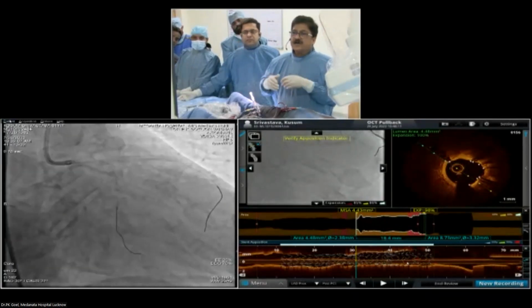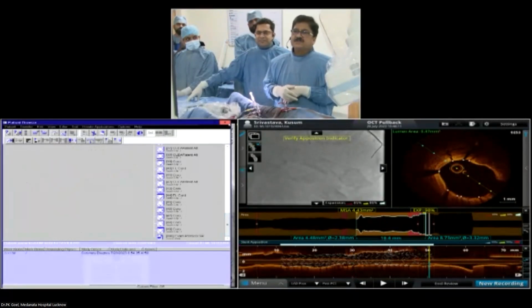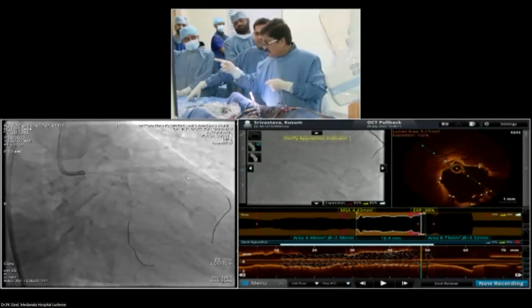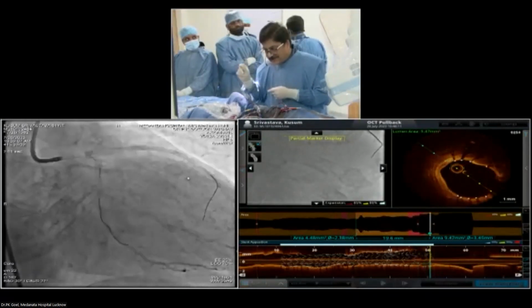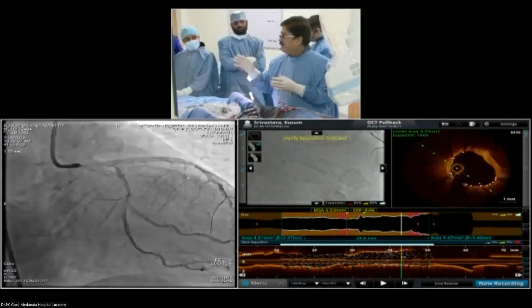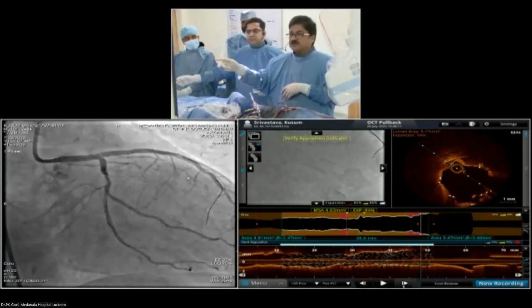So you put a stent from the mid part of the LMCA to the LAD. Yes. Can you show the proximal edge of the LMCA? Yes, that is the proximal edge of the LMCA. No dissection. Well, I have done an OCT. It shows a dissection of about 15 degrees to 3.5 mm length. So I think that is okay. I can show you the OCT. After that, we did a kissing balloon. Move forward. I'll show you the OCT at the end.